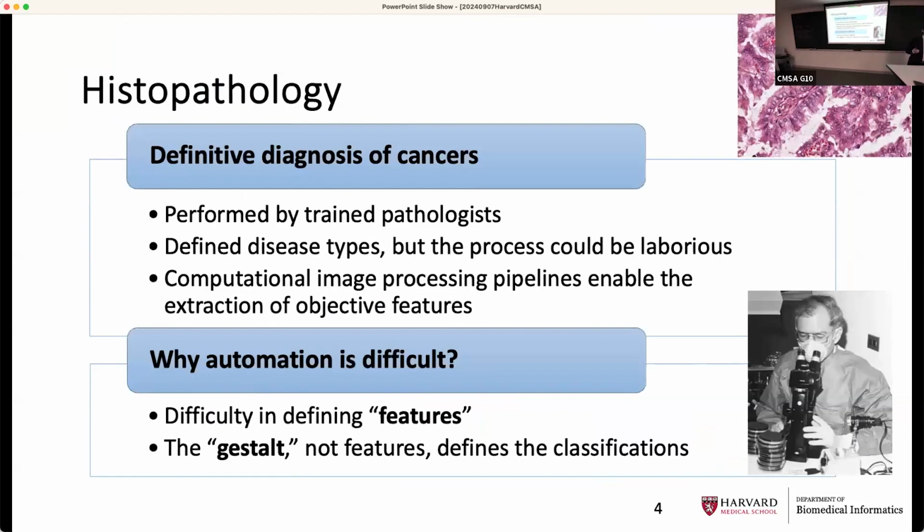So to understand the clinical question we are facing, let's start with the really basics. How do clinicians diagnose cancers? How do they identify different types of cancers requiring different forms of treatment? The procedure will usually involve taking a piece of the sample from our cancer patients and processing the sample into thin microscopic slides, staining them with appropriate chemicals, and observing them under the microscope. So based on the experience and the expertise of our trained clinicians, and more specifically, the specialists in pathology called pathologists, based on their evaluation, they will provide us with the diagnosis and the disease subtypes.